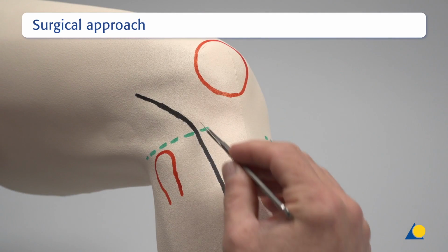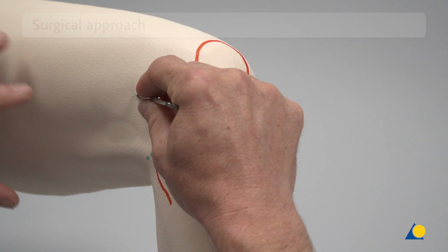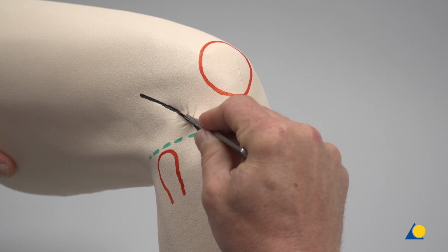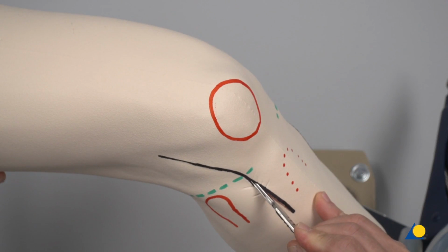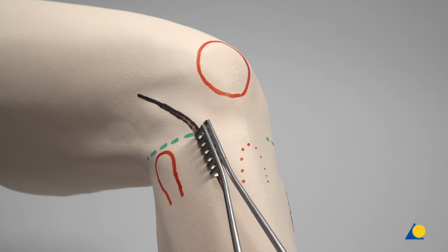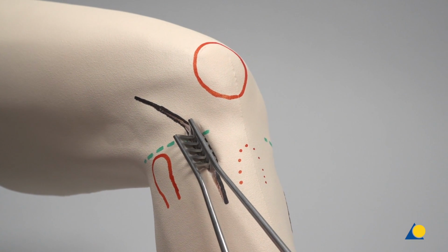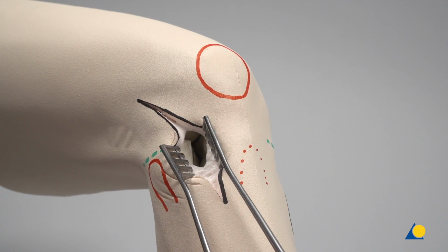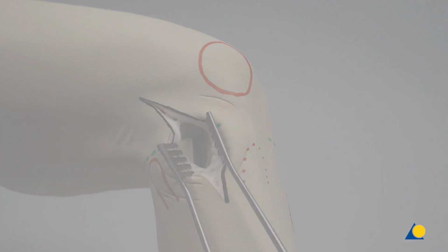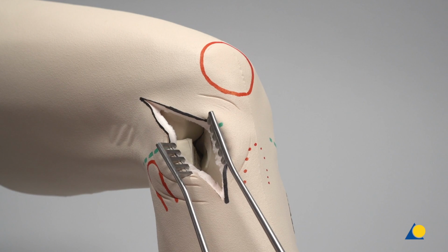A distally directed curved hockey stick or straight skin incision is made from the lateral epicondyle over the tibial tubercle. In the clinical situation, the anterior tibial muscle is detached approximately 5 mm away from the tibial ridge. A submeniscal arthrotomy is performed below and parallel to the lateral meniscus, which provides favorable reduction control.